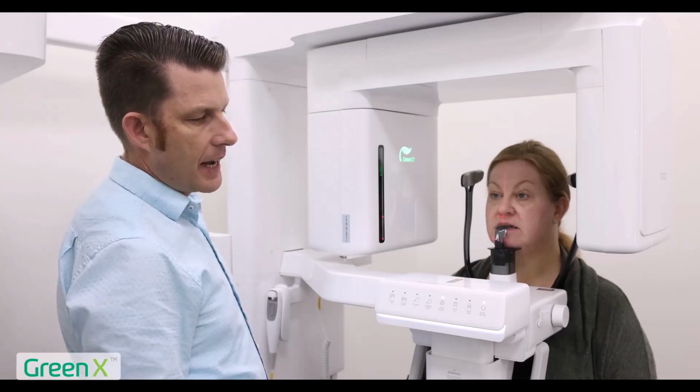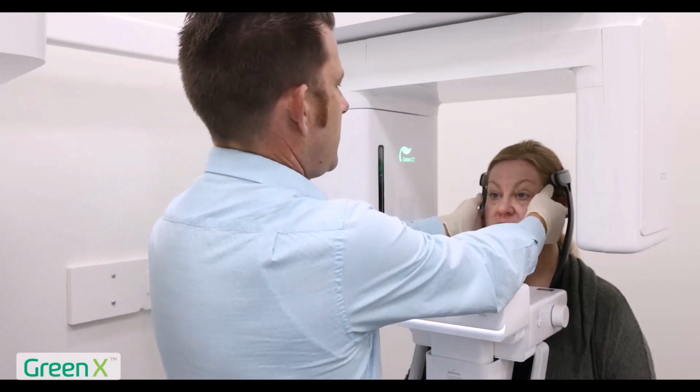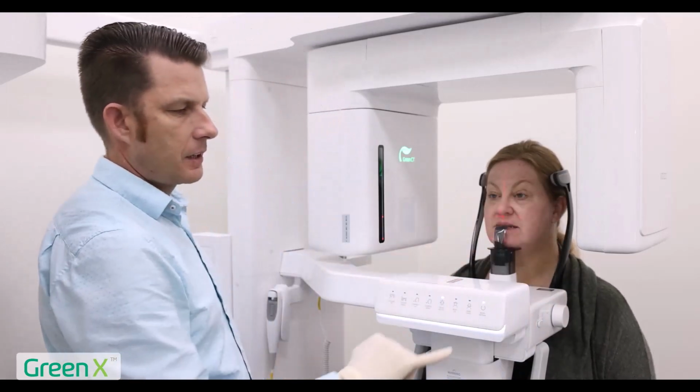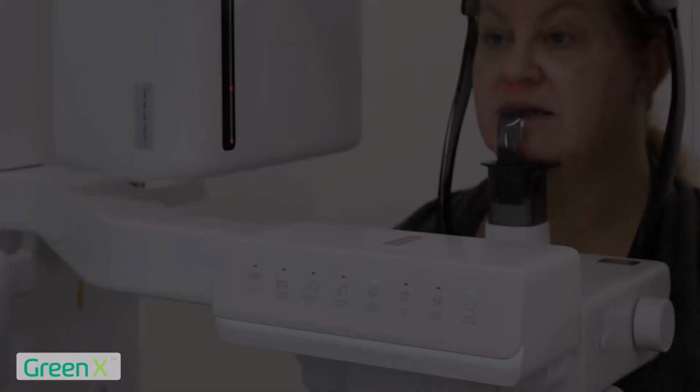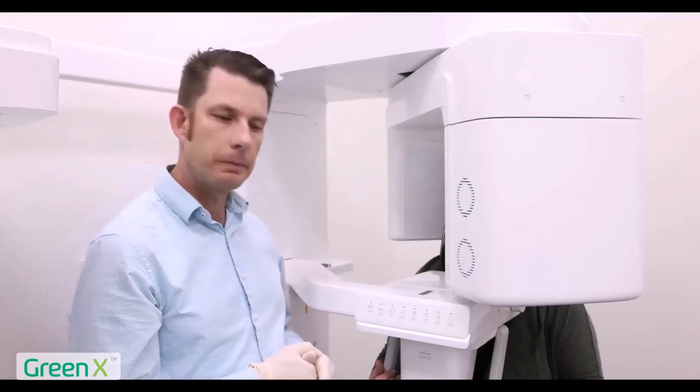I'm going to go ahead and close my temple supports. Let's straighten our patient out here a little bit. There we are, right there. I'm going to click ready. Positioning is complete. Go ahead and step out of the room and capture our image.